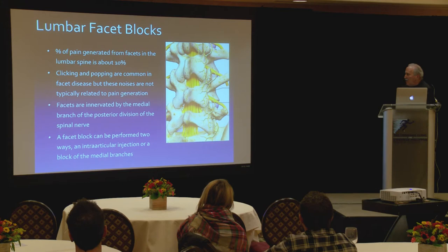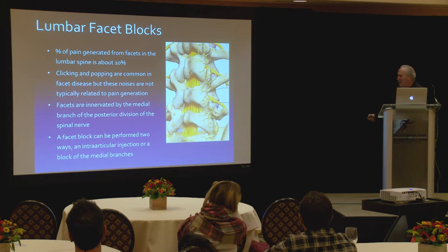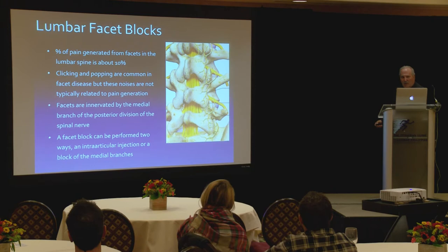Lumbar facet blocks. It's not as common for lumbar facets to cause pain, but you can see the medial branches that innervate these joints. If we're concerned about the joint itself causing pain, Dr. Evans can either do a medial branch block, so block the sensory nerves on the outside, or put the needle into the joint and do a capsular block.